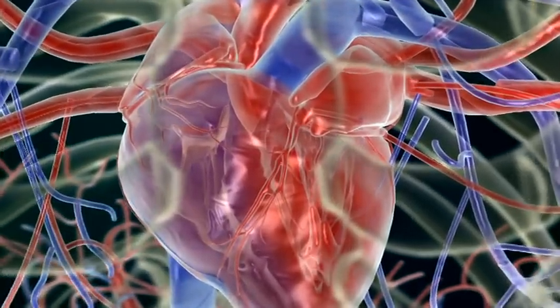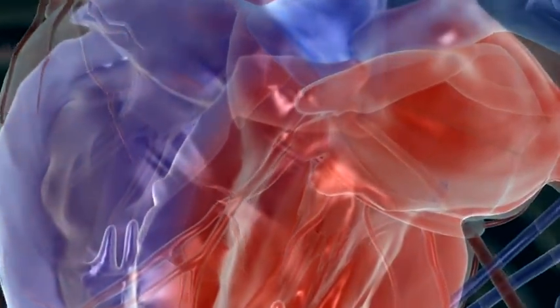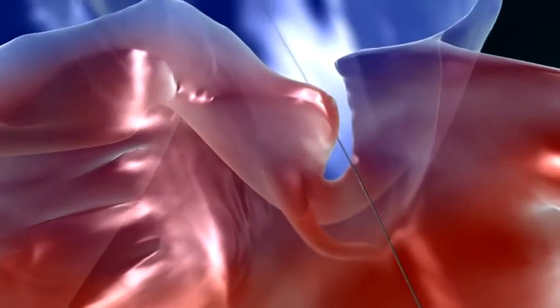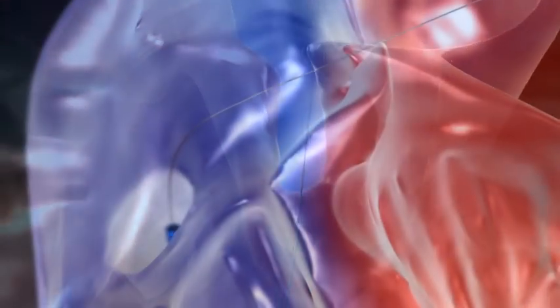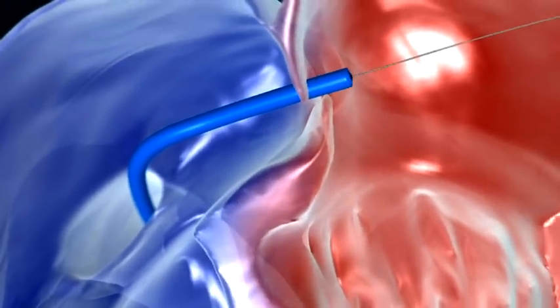The NHS is currently in development of a significant new PFO closure device. This delivery system, after catheterisation in the femoral vein of the leg, is threaded along a guide wire to the right atrium of the heart and through the PFO into the left atrium.